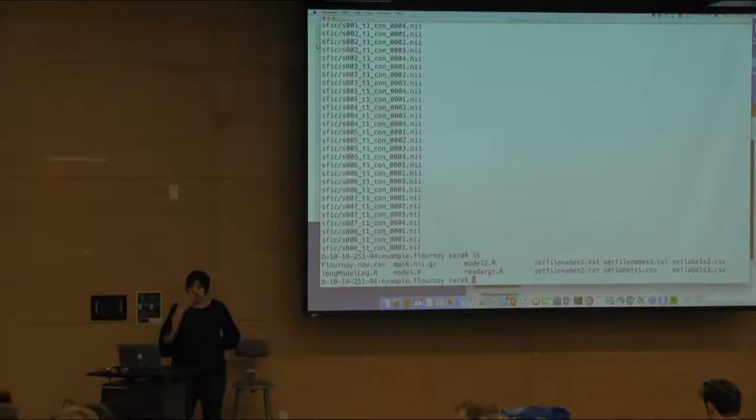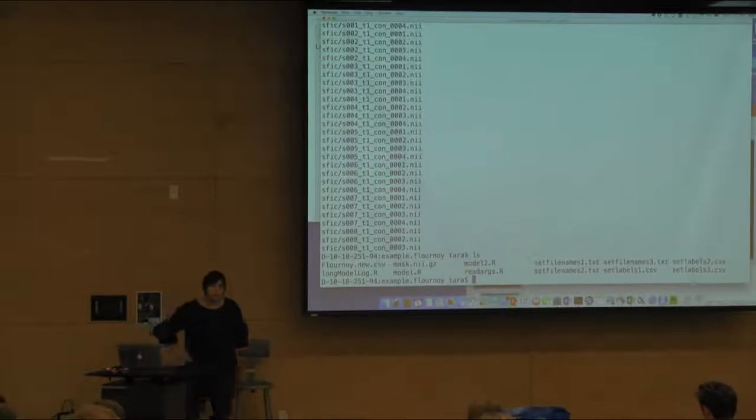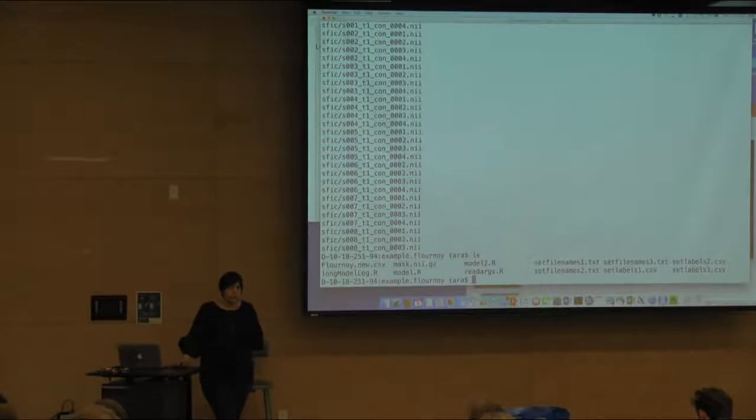So is it possible to use the second level individual maps? Because I know with FSL, for event-related designs, there's some question about how the scaling works at the first level with the single runs, that makes those estimates less reliable, or it's unclear how they're scaled exactly? Well, we've been using t-statistics, so those are scaled, and so you can use those. It's true that there may be benefits to using the estimates versus the statistics. Statistics may not be as good as the estimates, but I think in practice you can certainly use either.